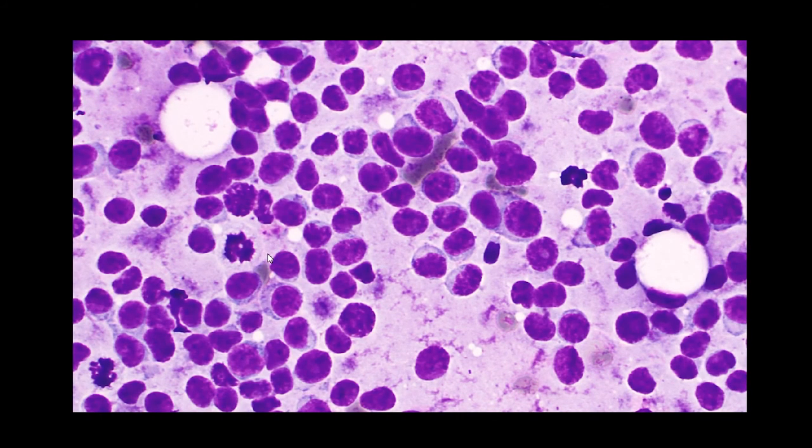So you can see the cells do have cytoplasm. It's not that obvious, but there's a little rim of cytoplasm around each of these individual cells, and it is a little darker towards the margin of the cytoplasm. So these cells here are looking really quite lymphoid.